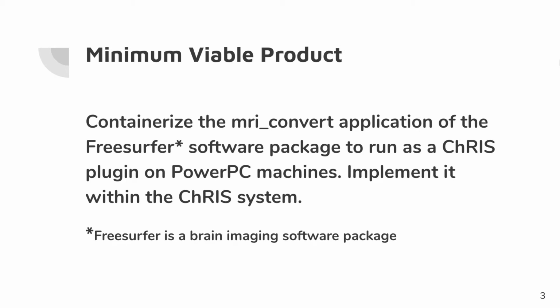Our minimum viable product was to containerize the MRI Convert application of the FreeSurfer software package to run as a CRIS plugin on PowerPC machines and to implement this into the CRIS system. To clarify, FreeSurfer is an open-source brain imaging software package, and MRI Convert is an application of this package that converts between different file formats.